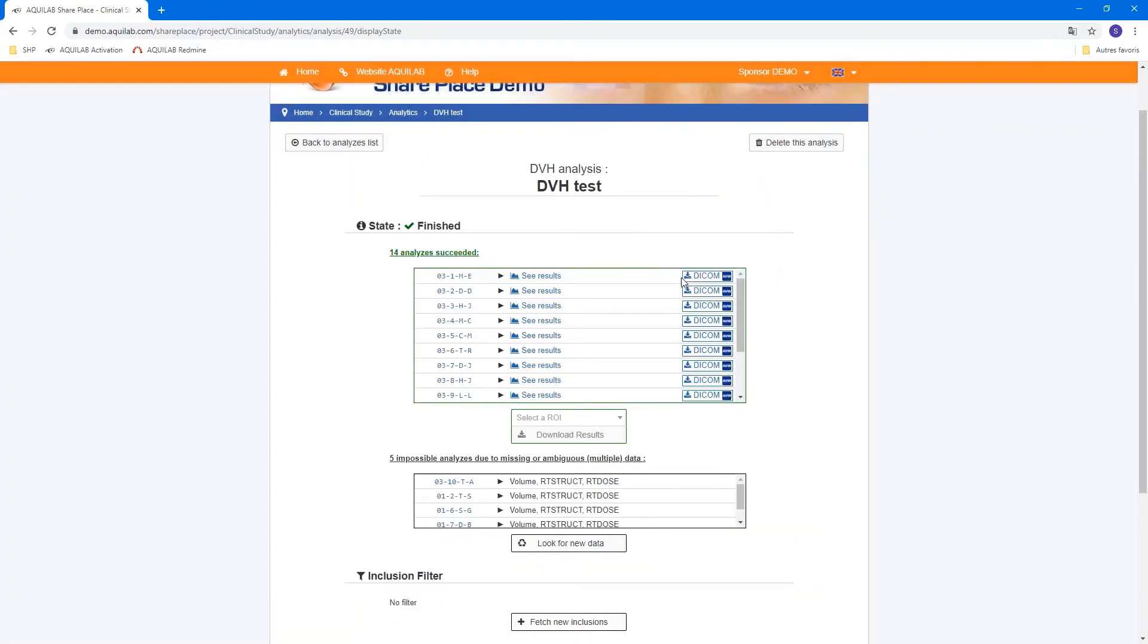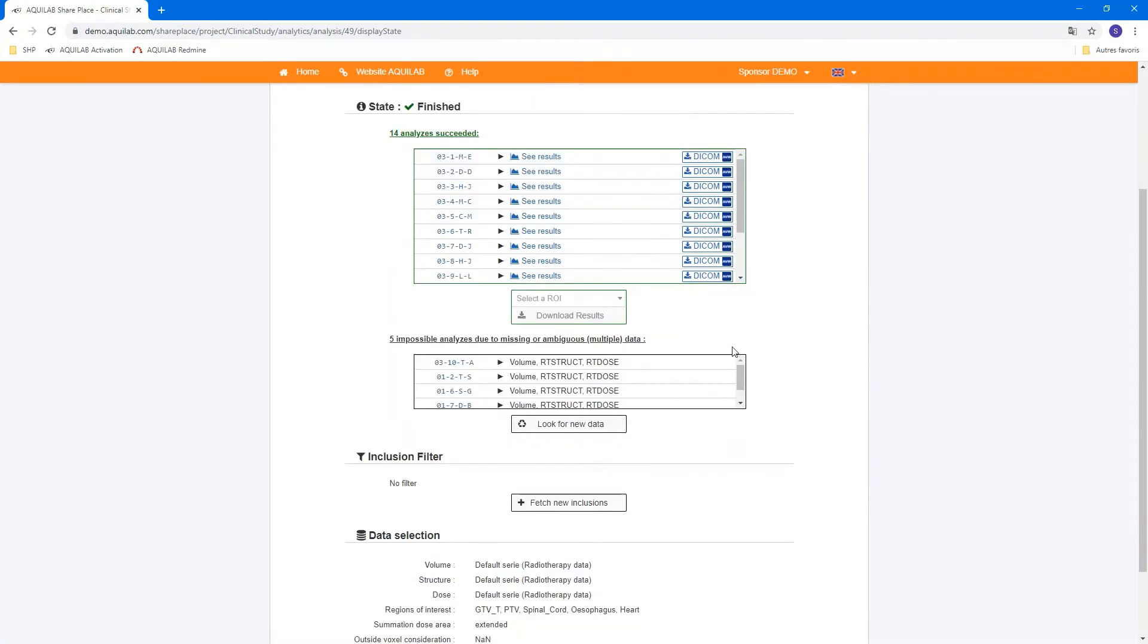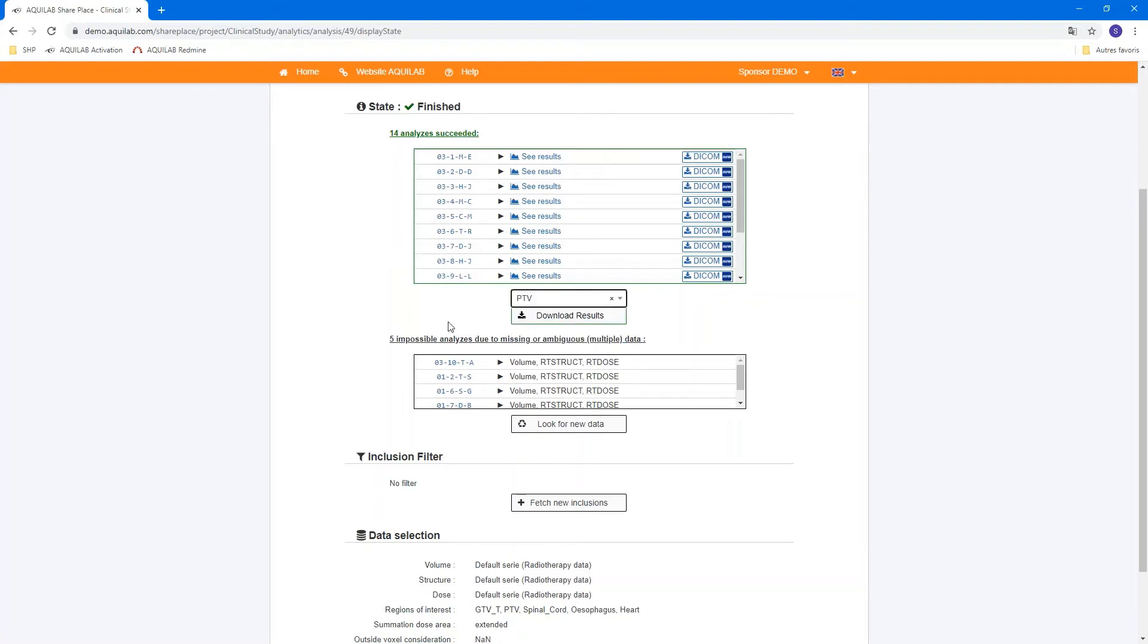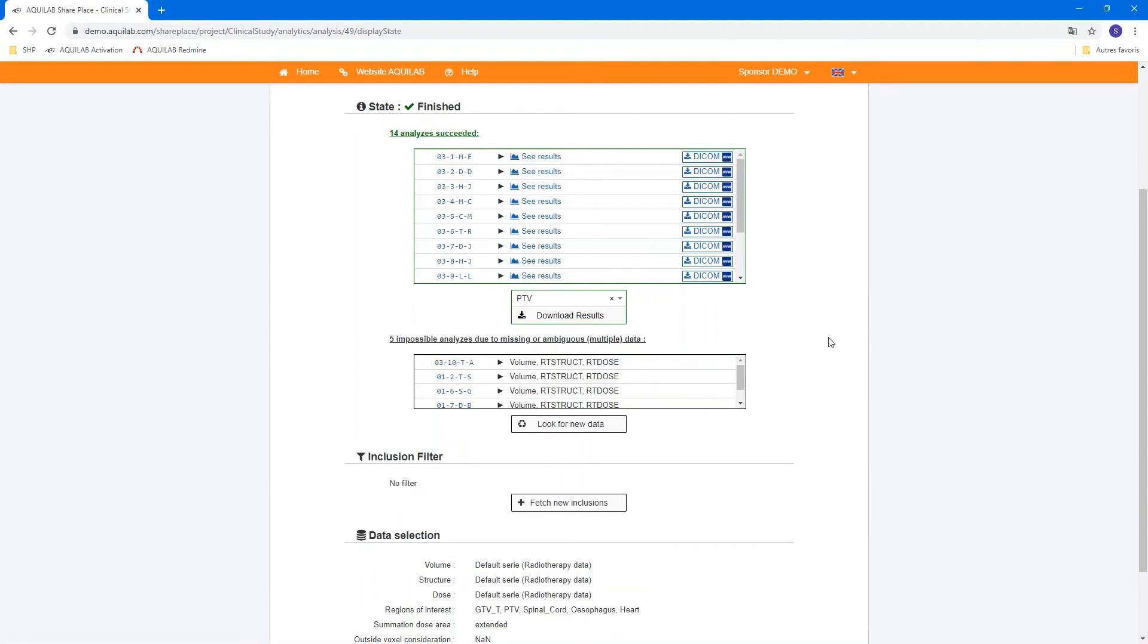You can select or deselect all and just see one structure if you need it. If you want, you can have access directly to DICOM data if you want to see it. You can also select a region of interest to download results into CSV format. You can see some analysis were impossible due to missing of RT struct or RT dose, for example.